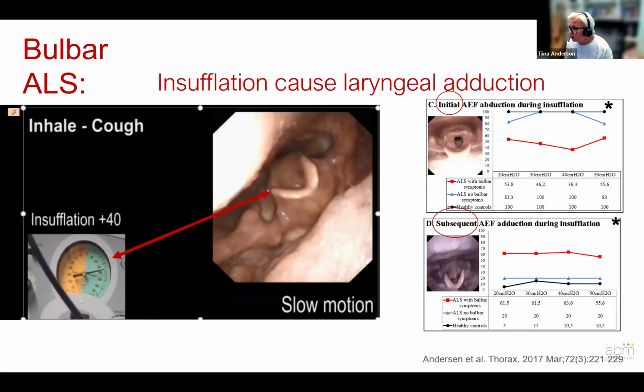And in this study, we had both bulbar ALS patients, demonstrated on the graph to the right with red, and non-bulbar ALS patients, represented with the blue line. And then we have this black line, which was another new group of healthy individuals, gender and age matched to our ALS population. And bulbar ALS patients had a really, really different response from the non-bulbar patients and from the healthy.